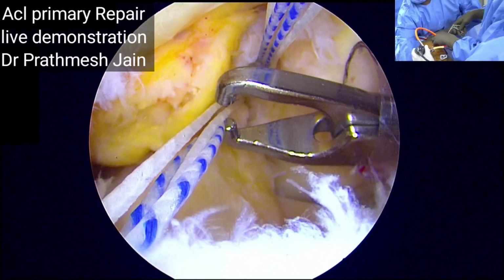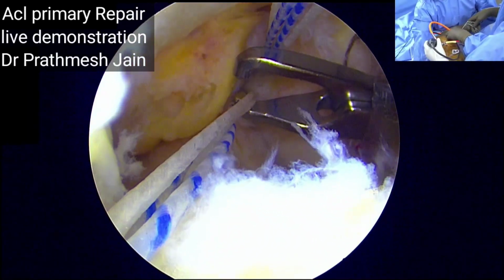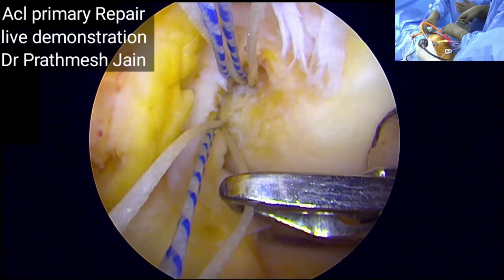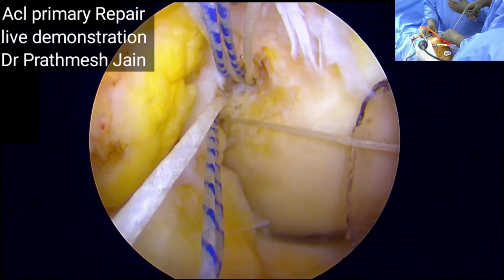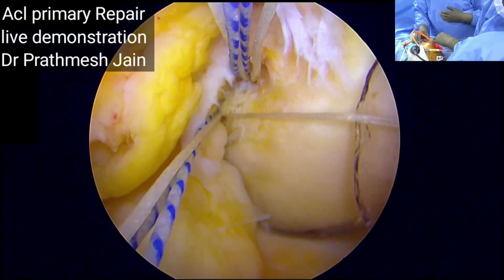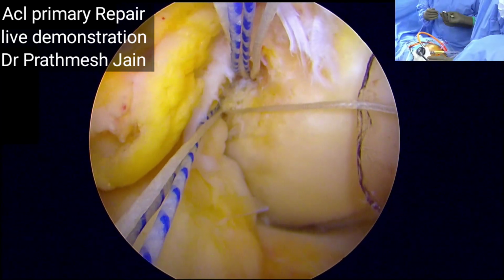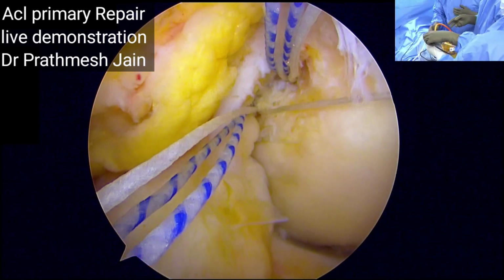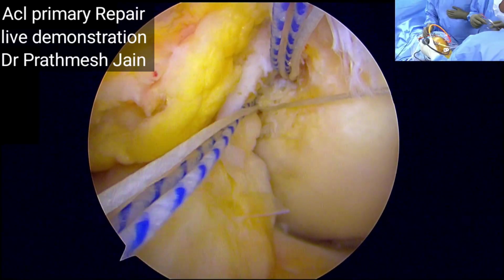We will be starting our repair from inferior to superior, okay? And this kind of a repair will be done. This is a fine repair, something like our rotator cuff repair, and we will be using a knee scorpion for this kind of repair.